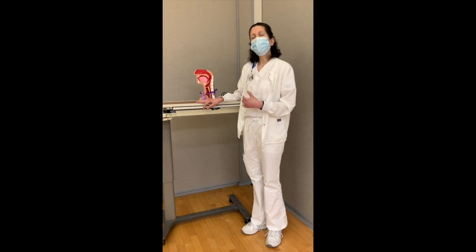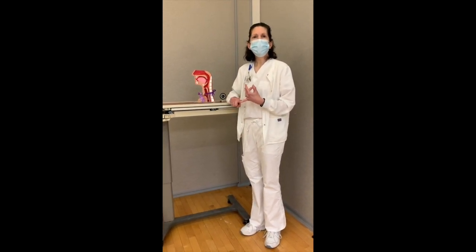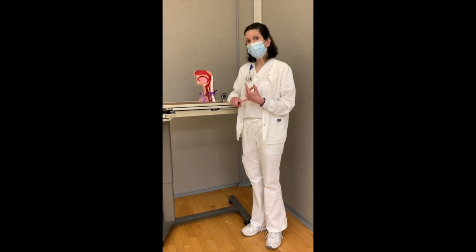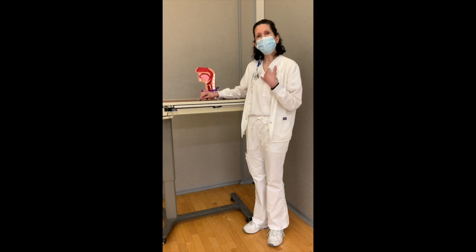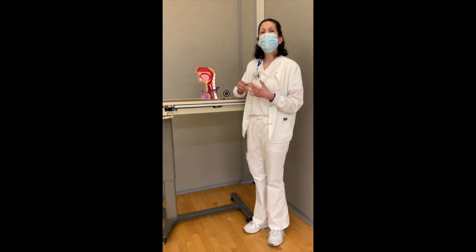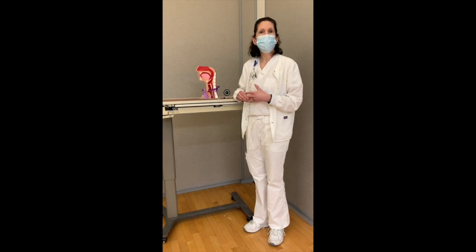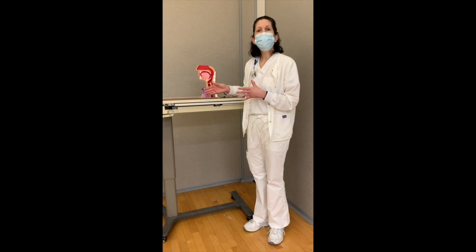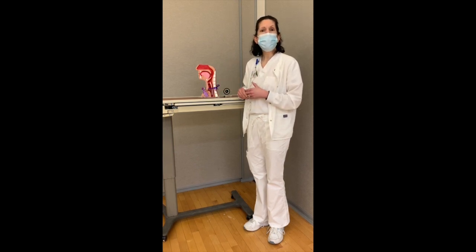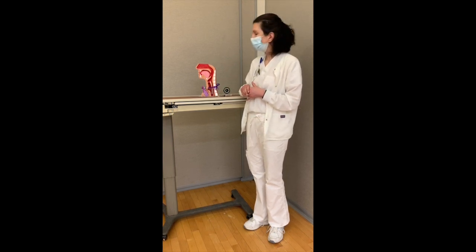So it's an important part of your assessment to know if the tracheostomy tube has a cuff, as evidenced by the presence of this pilot balloon that you'll see outside the patient's chest, and if the cuff is fully deflated. Respiratory therapy is the primary manager of the cuffs. If you need any assistance or have questions, they're happy to help out and resource for that, because that is a very important safety feature.